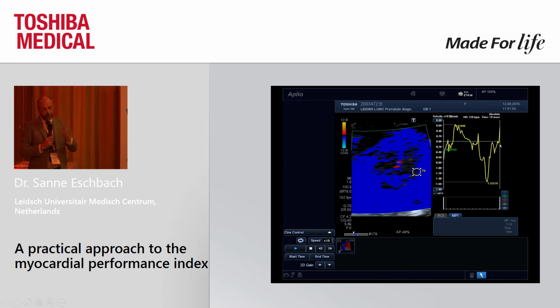But if that would be a problem, then they wouldn't have the sensitivity. In fact, if you look at patients and you do the measurement, you have a very clear differentiation between the normal ratios and the abnormal ratios. That's what we did already. But I will look in my PC if I have it with me. Yeah, but it's a good question.